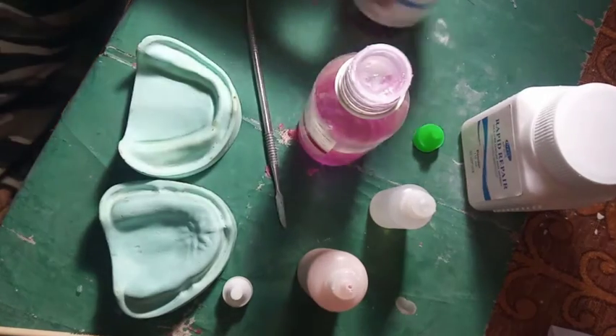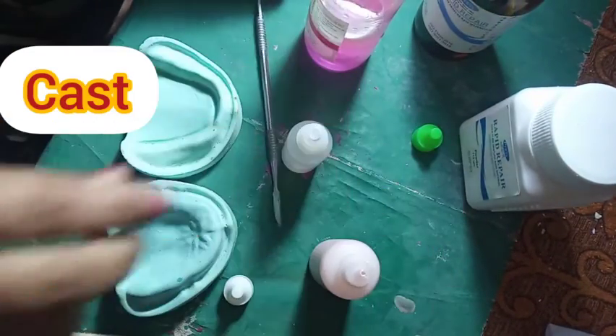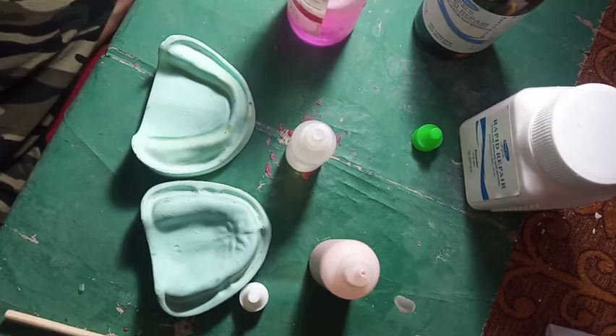So, what do we need? Monomer, Polymer, an eye dropper. And we need two casts. We need a cold mold seal. We need a brush to apply it. We need a carver to remove the acrylic from the cast.